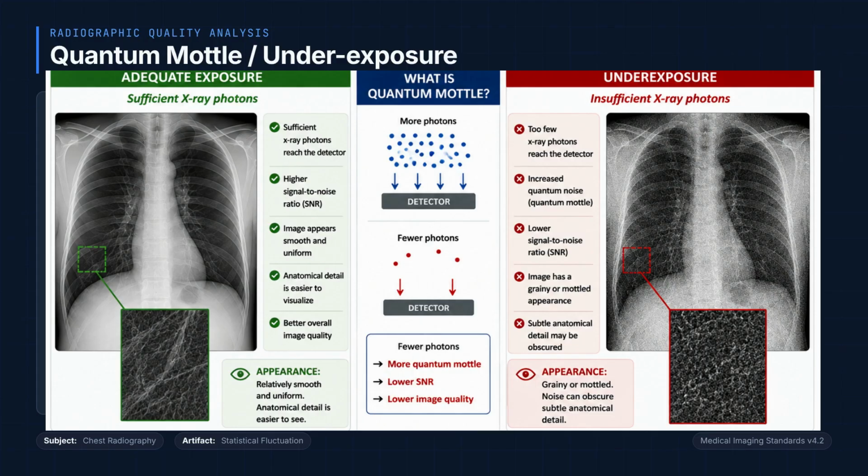Notice that the image has a relatively smooth and uniform appearance. With less visible noise competing with the image signal, anatomical structures and subtle details are easier to visualize.